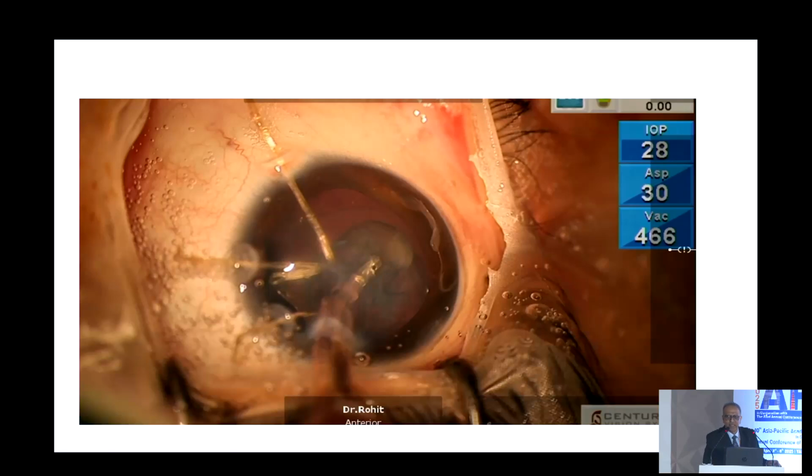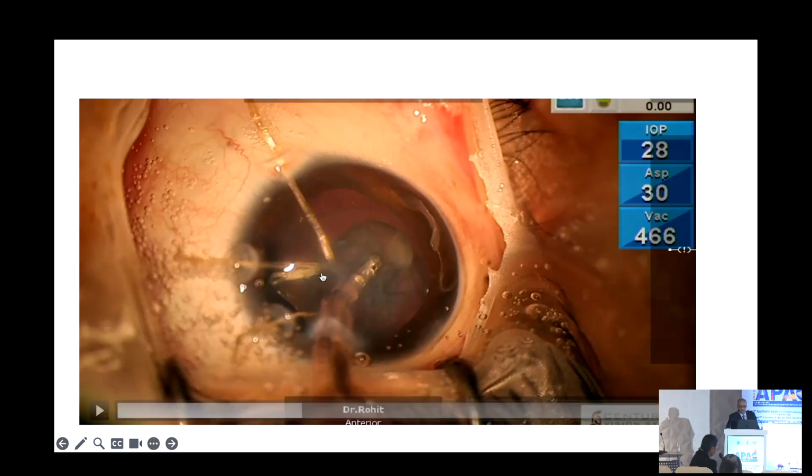Actually, you don't need to hydrodissect and you don't need to viscodissect because it's so soft. You can just aspirate it like a congenital cataract because there's no nucleus in it. And you could consider in this case using a CTS with the iris hook as your retractor because it would more evenly spread out the forces and make it more centralized. Good. So I continue now.